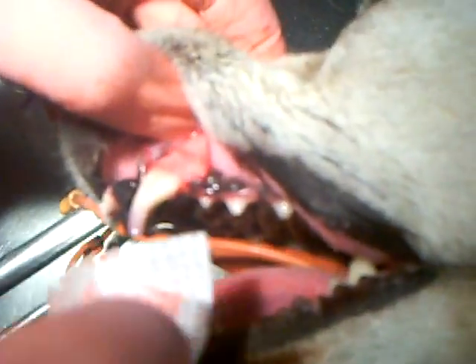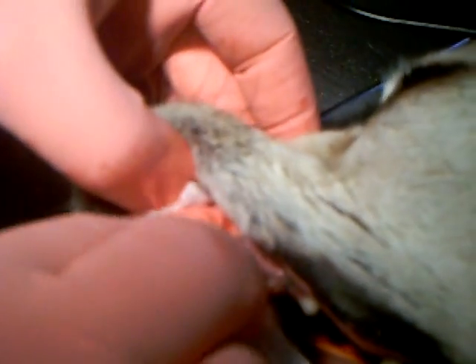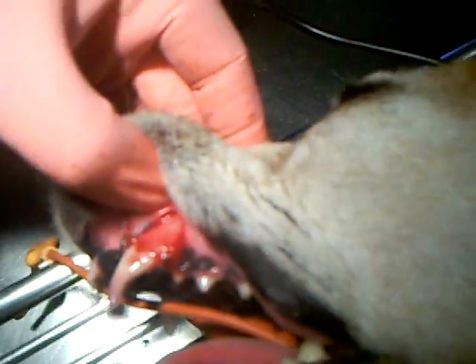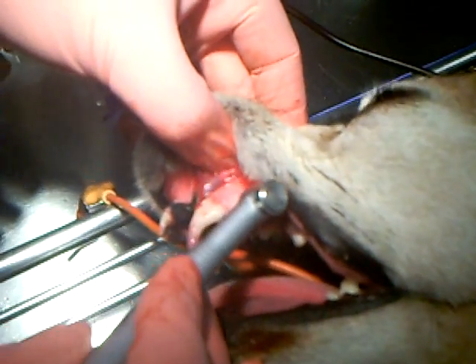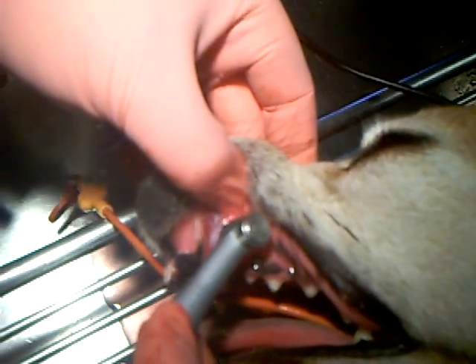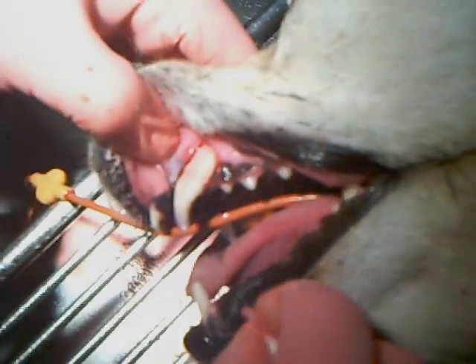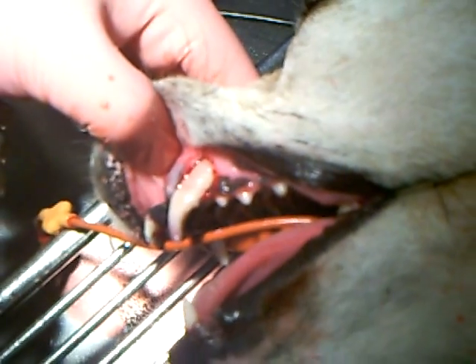Now that we have our gingival flap opened to where we can see the underlying bone, that's where we're going to use the high-speed drill. We're going to drill out the bone to find the root of the tooth. Now you can see that we've gone all the way around the root of the tooth with the drill and loosened up the ligament — the ligament that holds that tooth into place — and removed the bone holding it into place.